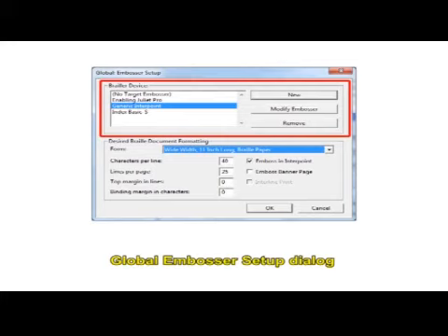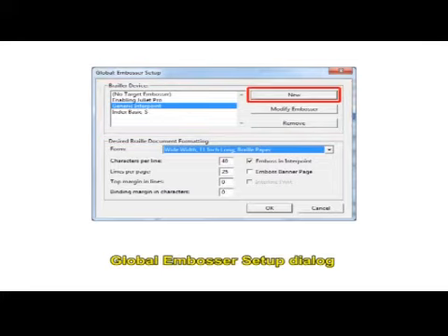During the DBT installation process, you may have chosen to install one or more embossers. If so, they will appear in this list. If the list only contains no target embosser and you wish to set up one, tap to the New button and press Enter. New button will take you to the embosser setup.